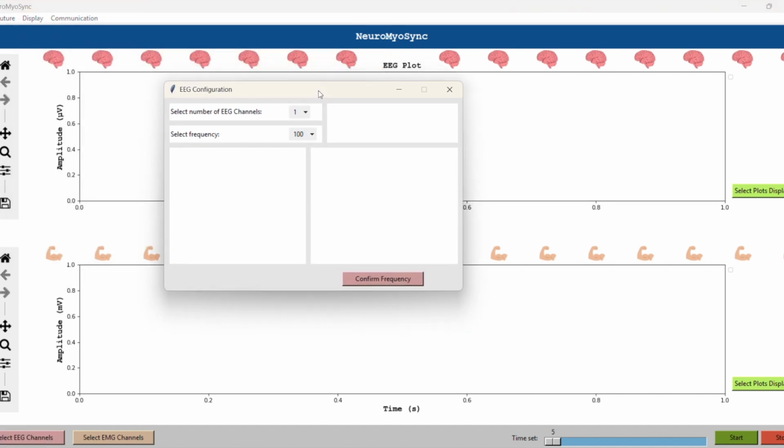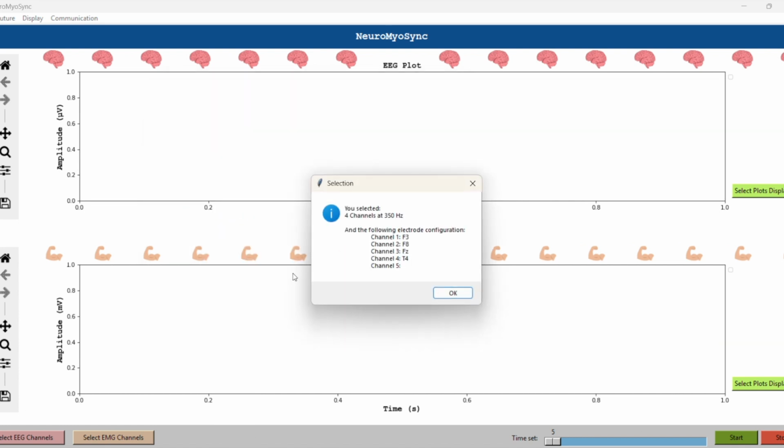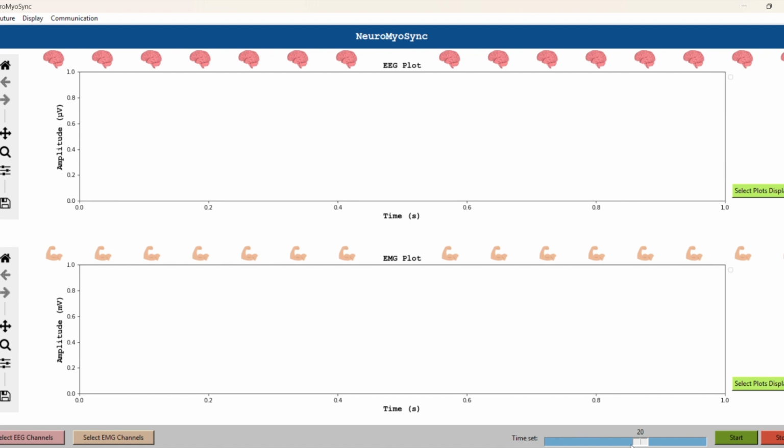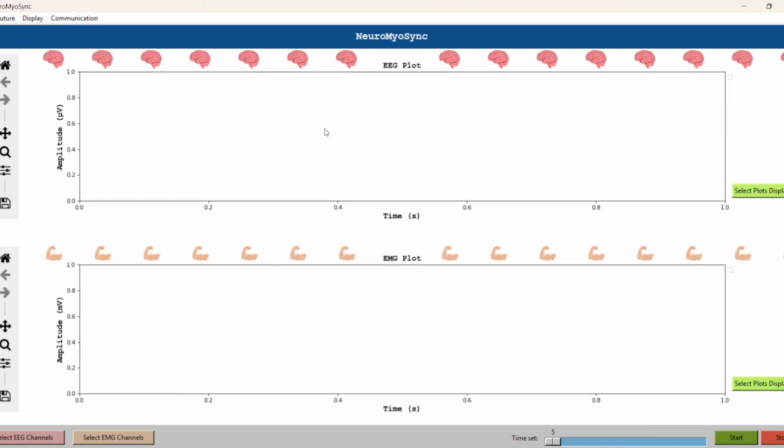EEG is already connected, so if I went to select EEG channels, I can also select the number of channels I'm looking to record and the frequency, confirm this, and here we have an option to choose which electrode placements you are recording. So once you confirm that, a pop-up shows what channels you're using and their labels. You can select the time here and start and stop a trial. Here you can choose which you would like to display, either EEG or EMG, and this is to see the plot a bit bigger. And then here we have open files, open a combined file, save and exit the GUI.